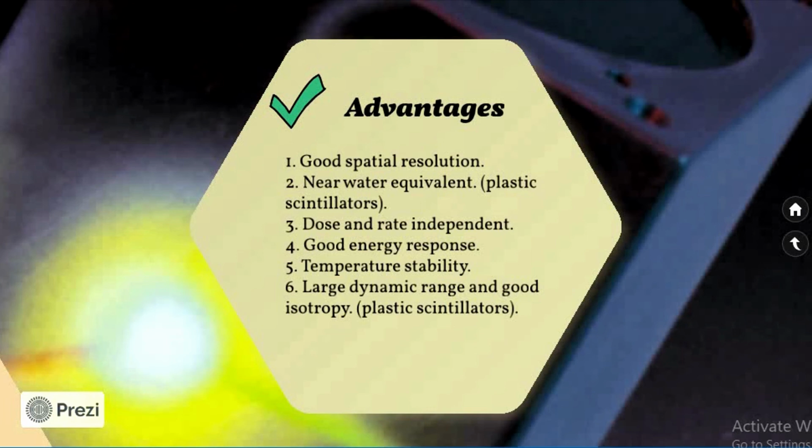The linear energy response of scintillator dosimeters makes them highly suitable for use in radiation therapy applications. Also, plastic scintillators show high stability with respect to changes in temperature, so they don't require a cooling system while being used.